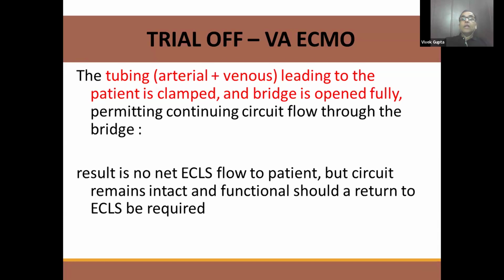usually clamped, but here we close the arterial and venous circuit limbs close to the bridge towards the patient's side, and we open the bridge. Now, only the blood will be circulating in the machine and nothing will be going to the patient.